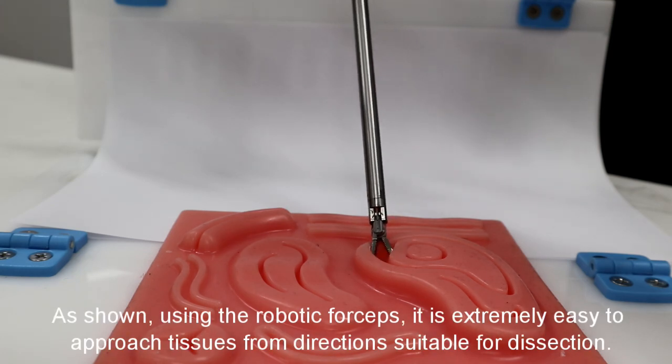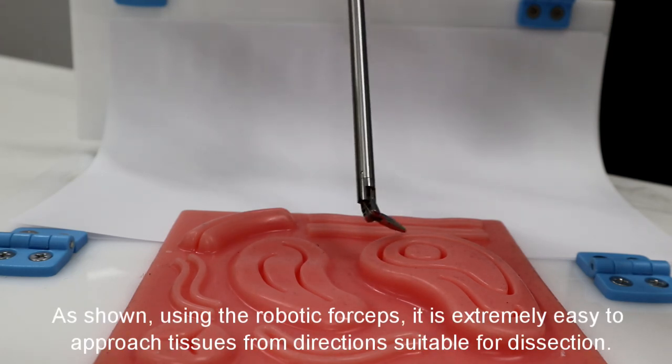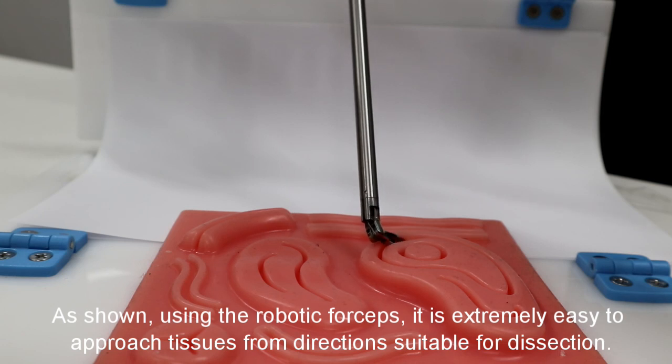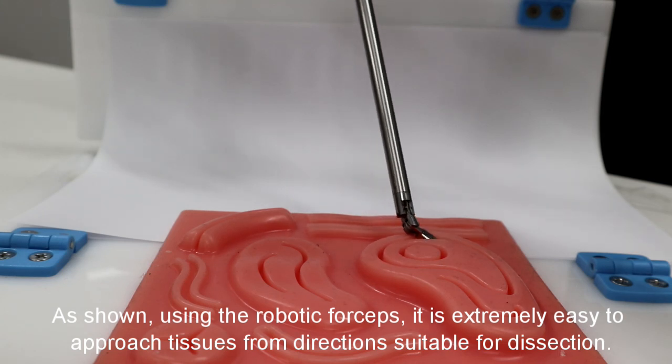As shown, using the robotic forceps, it is extremely easy to approach tissues from directions suitable for dissection.